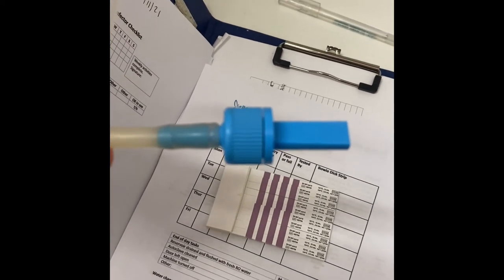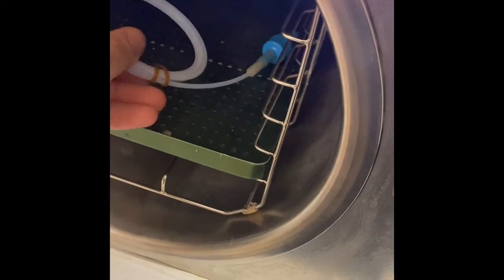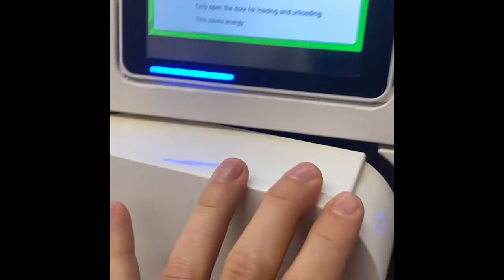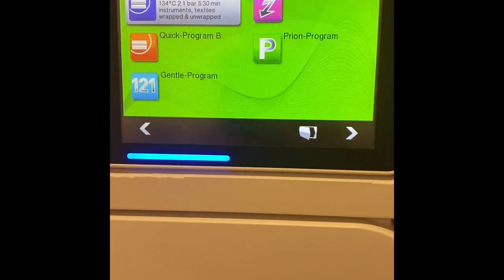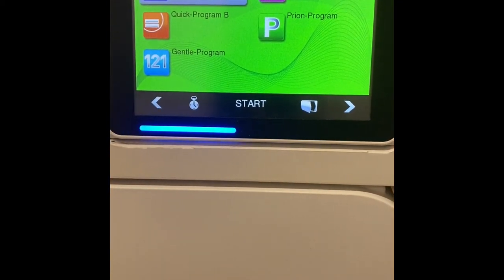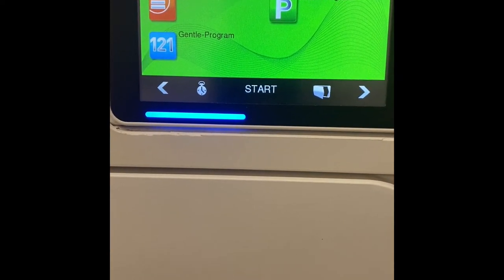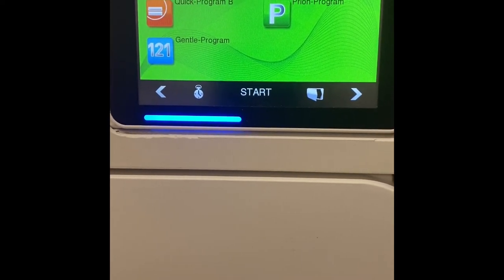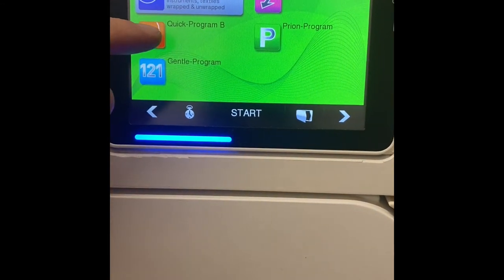Now we've loaded this, we can pop it into the autoclave and close the autoclave door. We then need to select a cycle which runs on a vacuum cycle — that could either be the universal program or the quick program B. It wouldn't be the quick program S because this is a non-vacuum cycle. So we'd select this one or this one.